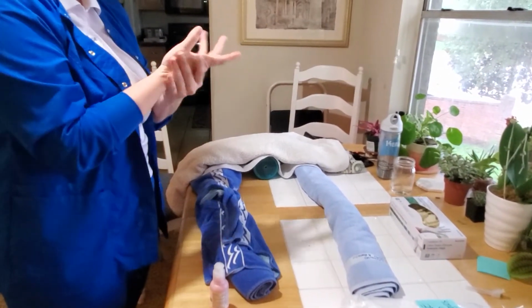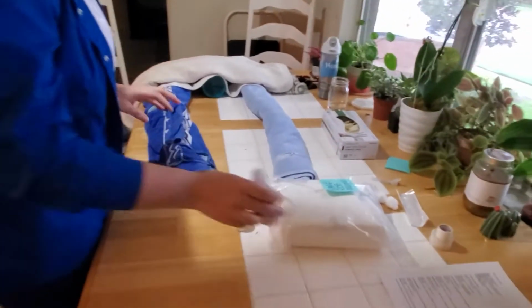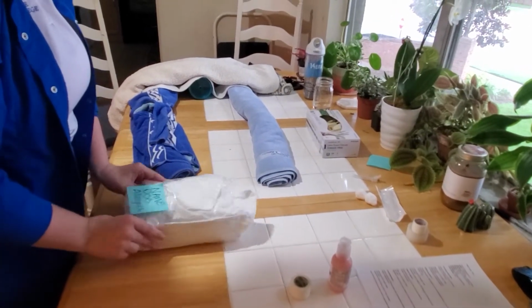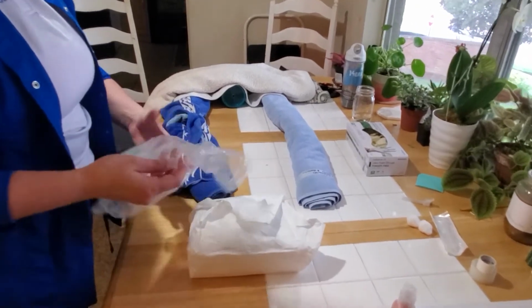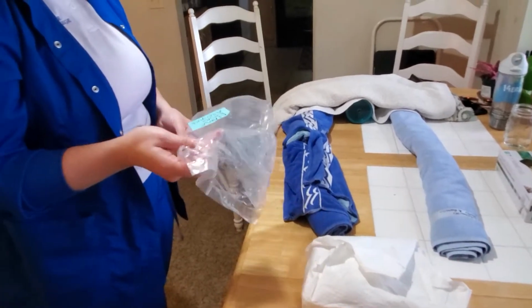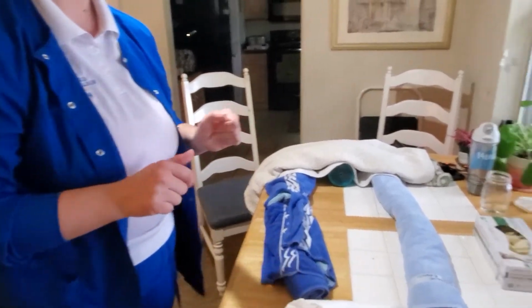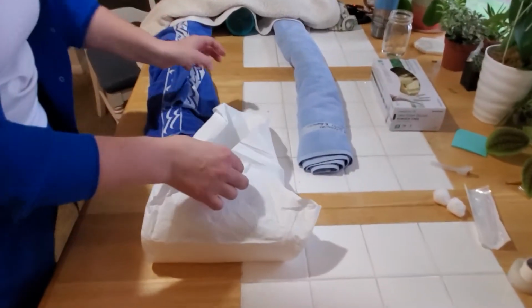And I will open my sterile kit. So normally you use this as a garbage bag, but I have a garbage bag right here, so I'm not going to be using this for this purpose for today. So I'll just be placing this next to the garbage bag, or in the garbage bag, I guess. Okay, so I'm just going to open this, just touching these tabs.